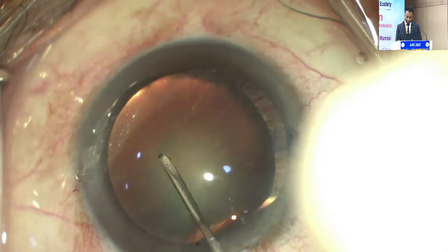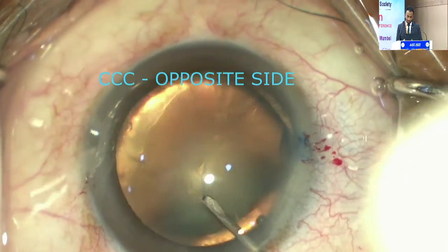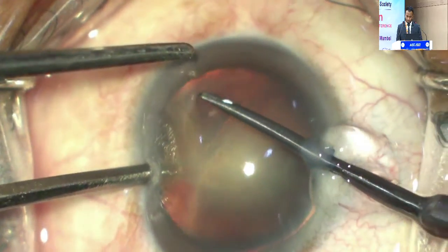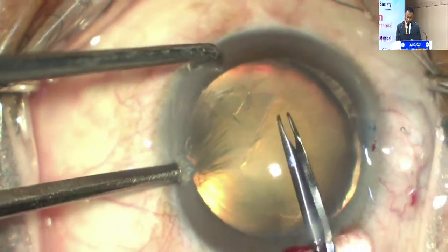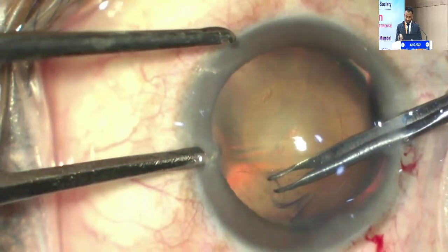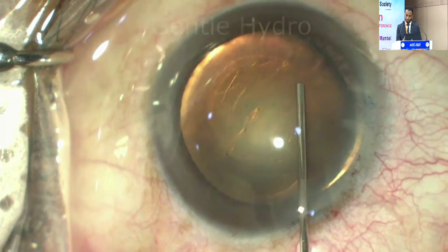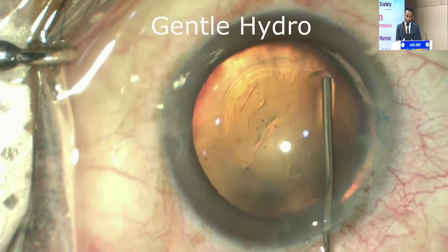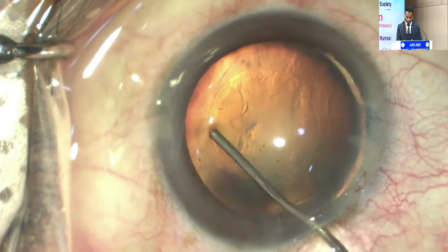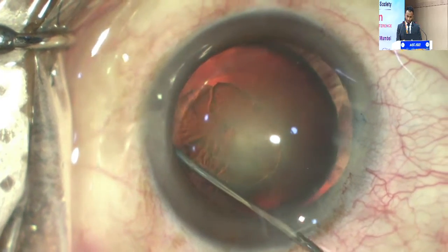You could see that the zonular dialysis is almost around 5 clock hours. So I've started the CCC in the opposite direction. Using forceps gives a more stable approach. Some people also use hooks during the extension of the rhexis so that it stabilizes the bag more. This was a traumatic young patient, so it was fairly stable. A hydrodissection procedure was done. You don't let the whole wave come to the opposite side or pop it out. Just enough to release the corticocapsular adhesions.